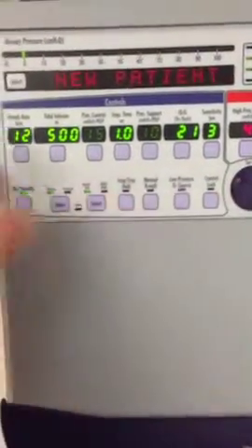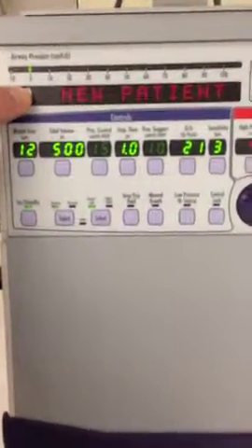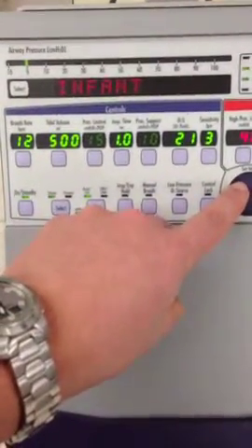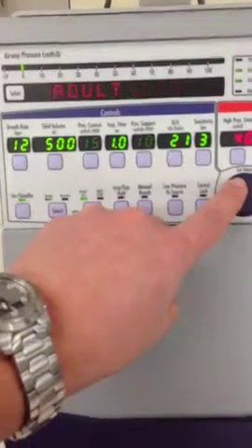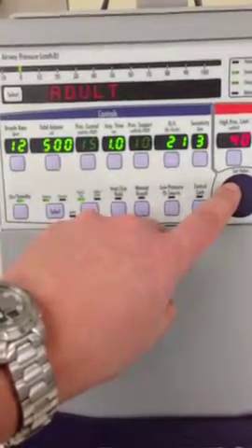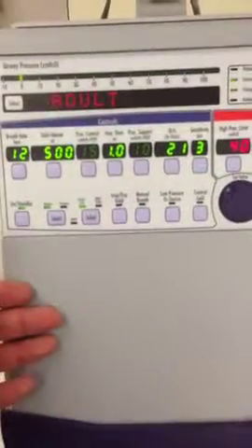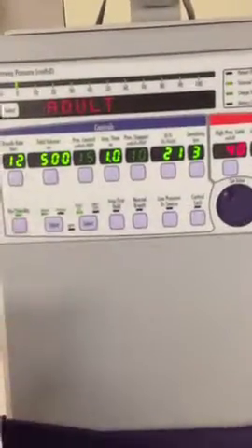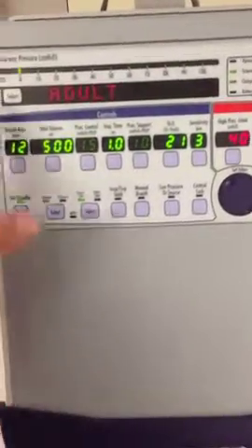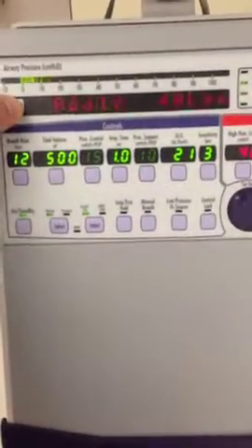Scroll over now to new patient. If I hit select on new patient, it's actually going to ask me to input the patient population or patient size. So I've got infant, pediatric, or adult. Now you as the user would have to make sure that you've got the appropriate interface to match the settings that you're putting in. So if it was an infant, have an infant circuit, pediatric, have a pediatric circuit. We are using an adult circuit here, so I'm going to go ahead and select adult.